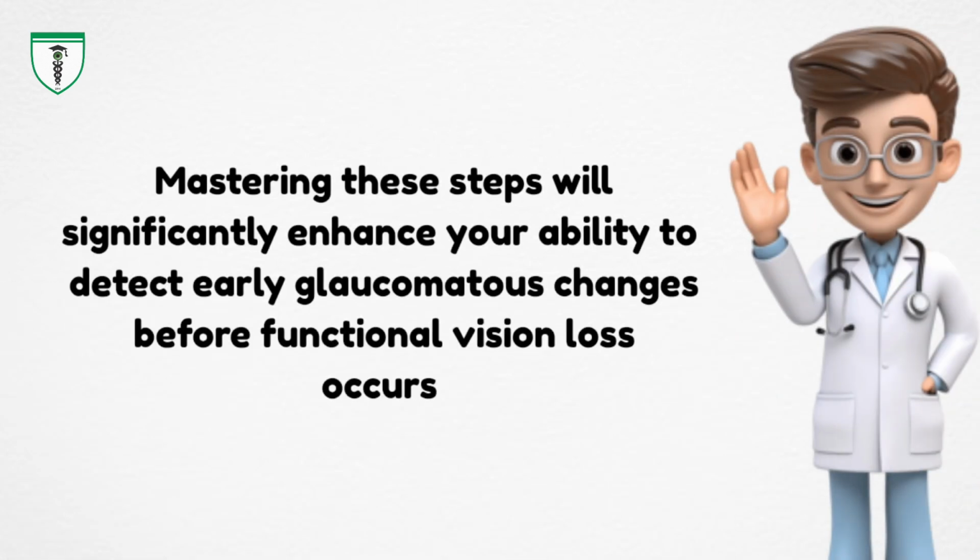Mastering these steps will significantly enhance your ability to detect early glaucomatous changes before functional vision loss occurs.